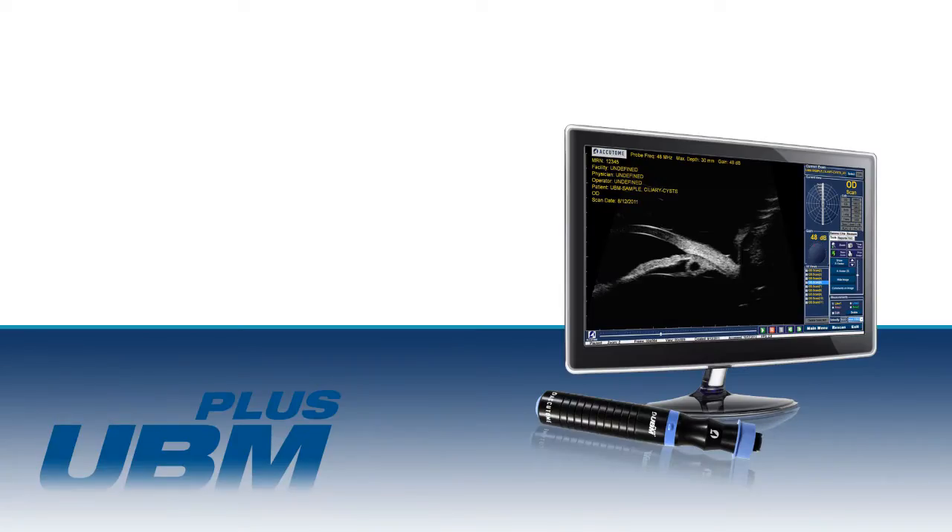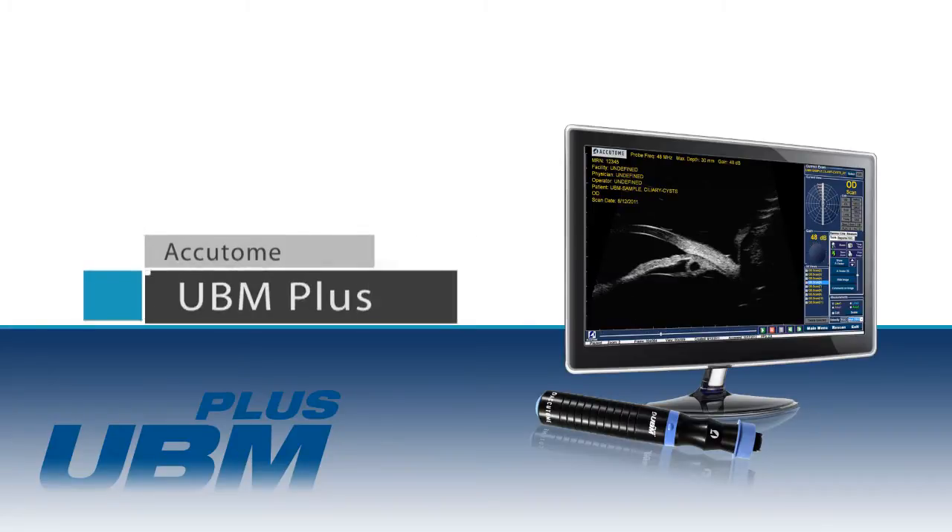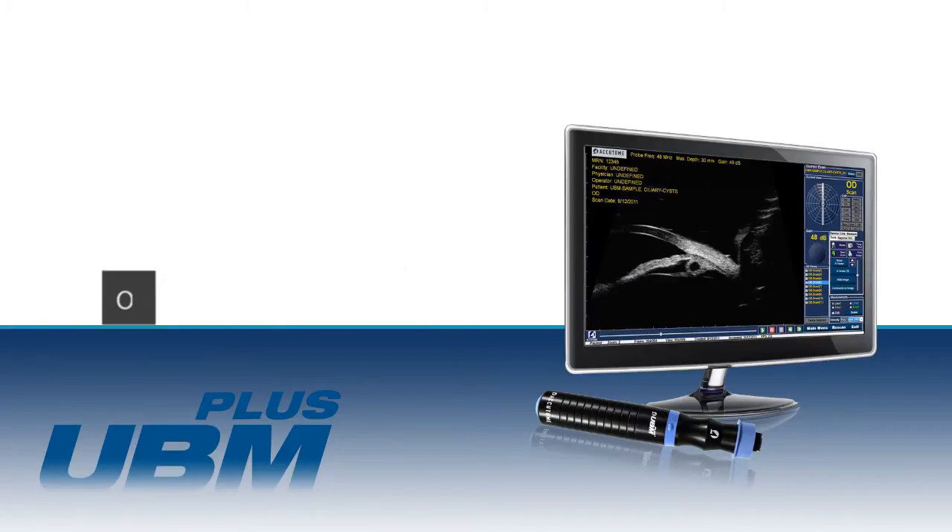This video will demonstrate the proper setup and technique for operating the Accutome UBM Plus.